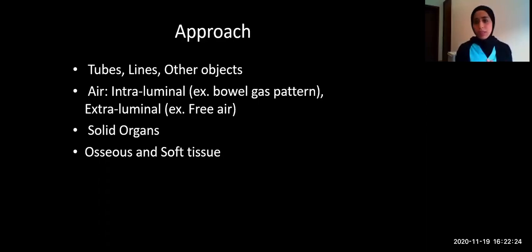Other objects like external artifacts or ingested foreign bodies, and air in the abdominal radiograph, are very important highlighted titles which you need to be aware of.